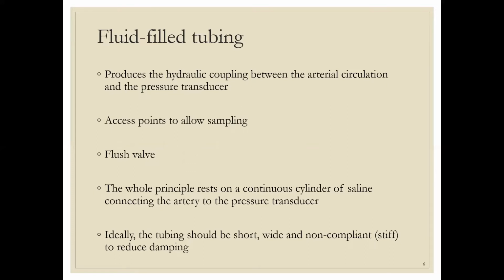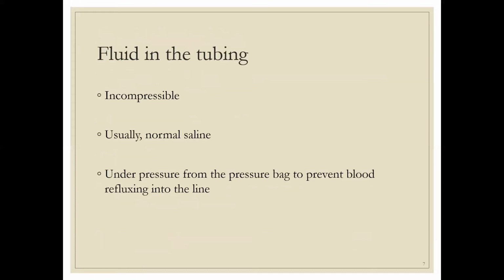So now within the arterial catheter there is blood which is getting oscillated at a particular pressure. This is getting oscillated at a particular frequency depending upon the pressure system. Now once we connect the fluid-filled tubing to the arterial catheter end, the pressure changes which are happening within the blood will get reflected to the saline in the tubing, and this saline will then communicate these pressure changes to the transducer, and it is at the transducer level where the data recording happens.